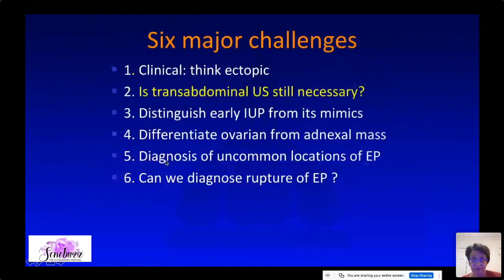Now, is transabdominal ultrasound still necessary? Again, we want to do things as quickly as possible. Oftentimes, at least in the US, they just order a transvaginal ultrasound. I really think in patients with ectopic pregnancy, it is absolutely necessary to do a transabdominal ultrasound.